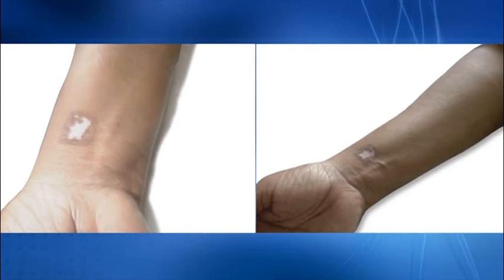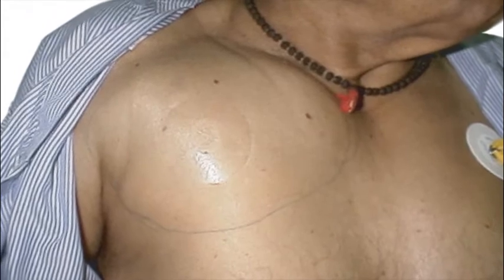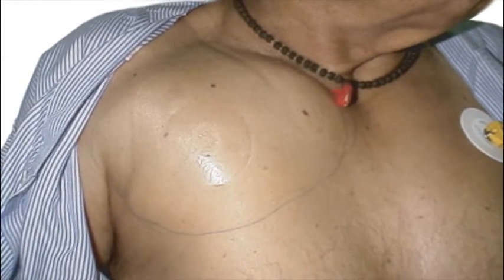This is an example of depigmented scar which happened because of very severe pressure applied on the artery after the intervention. This is an example of infraclavicular hematoma because of the perforation of some branch of the axillary artery. These are actually very rare complications and they can be dealt with without much of the problem.